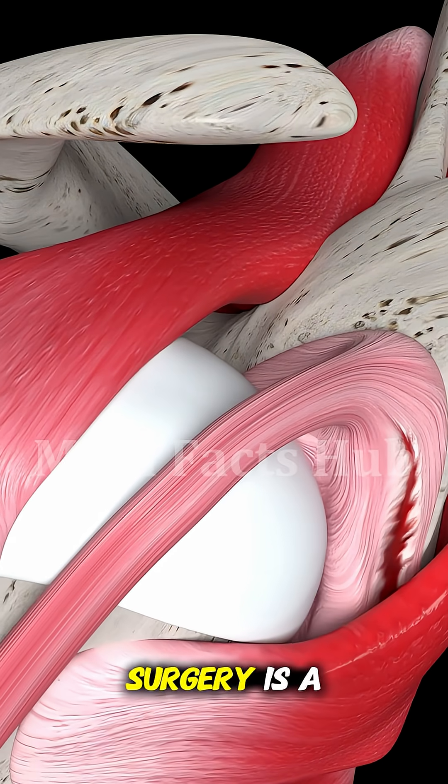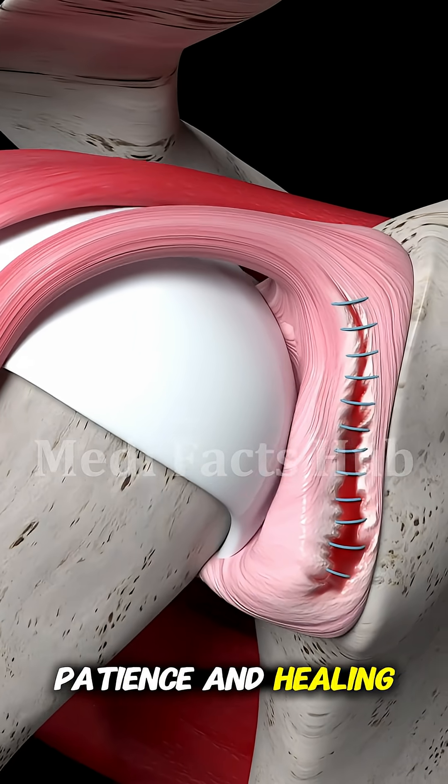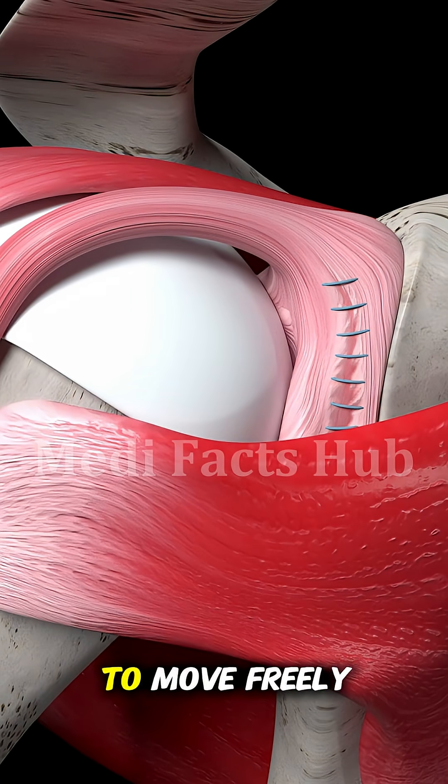Rotator cuff repair surgery is a perfect blend of precision, patience, and healing, giving your shoulder a second chance to move freely again.